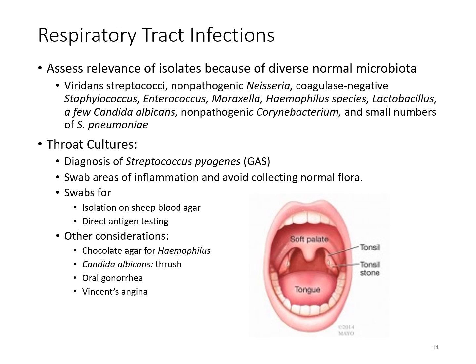If the physician is suspecting that there's something else causing this patient's infection, then they may request the culture to include things like a chocolate agar looking for Haemophilus, or if they suspect that there's a yeast infection present, they may state that, as well as some of the other potential infections that are a little bit rarer but could still be present within that specimen.